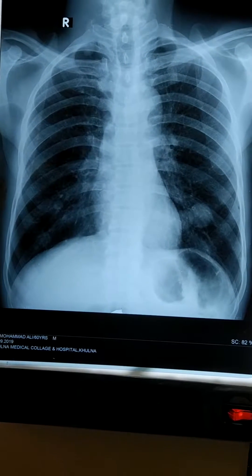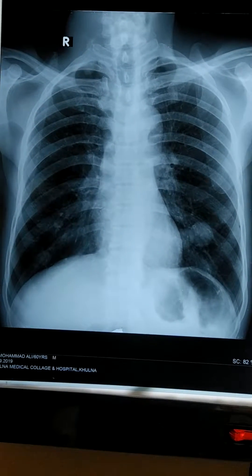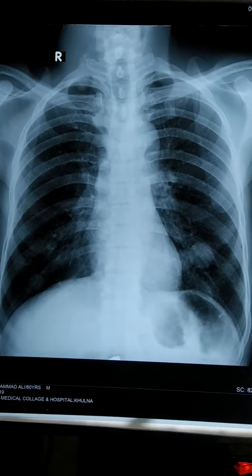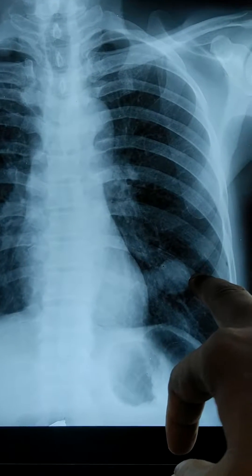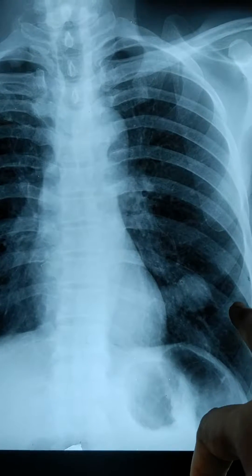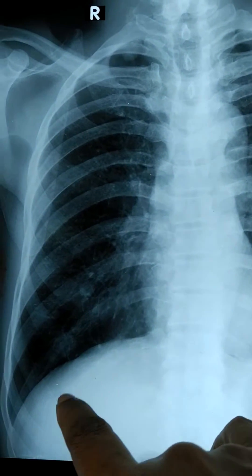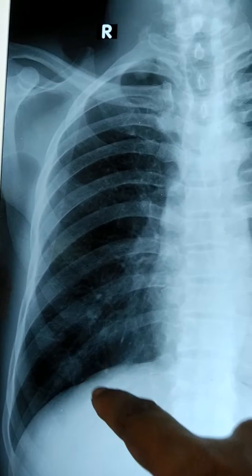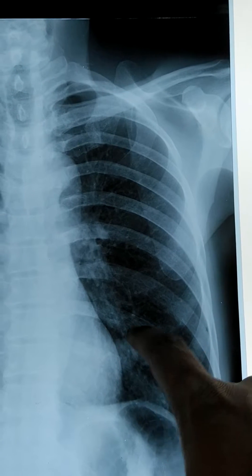Good morning. Today I am going to present a very nice clinical chest X-ray PA view. This chest X-ray shows a rounded radio-opaque shadow — a single shadow on the lower zone of the left lung field. Look very carefully: there is also a small radio-opaque shadow here, and a single large radio-opaque rounded shadow with a clear margin, as well as a smaller radio-opaque rounded shadow on the opposite side.